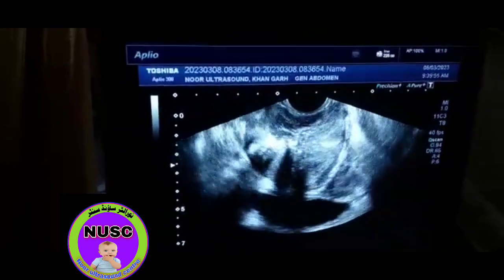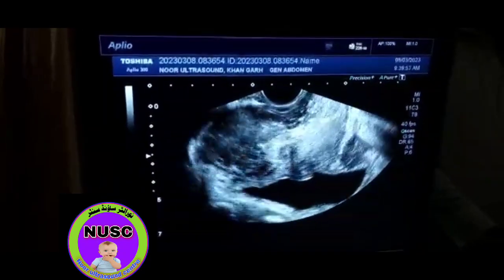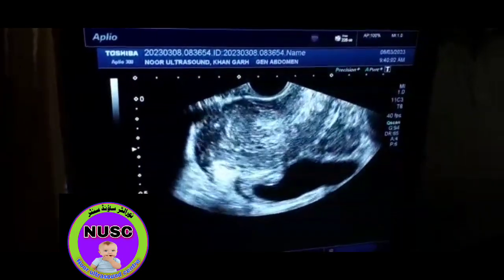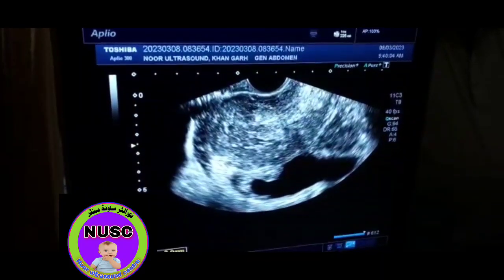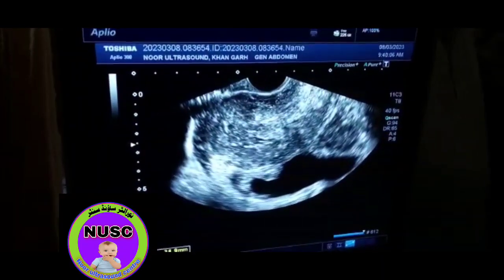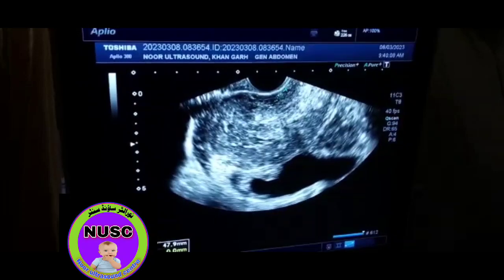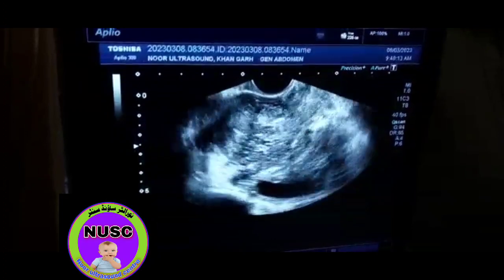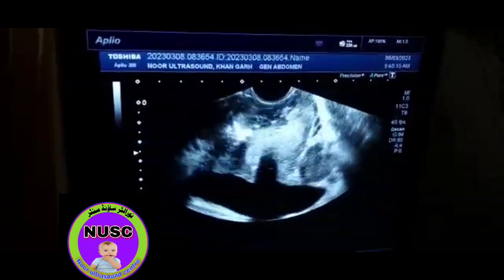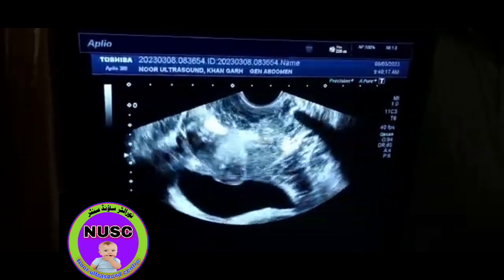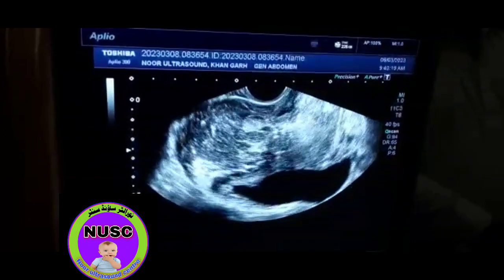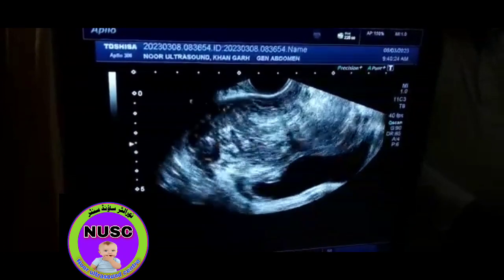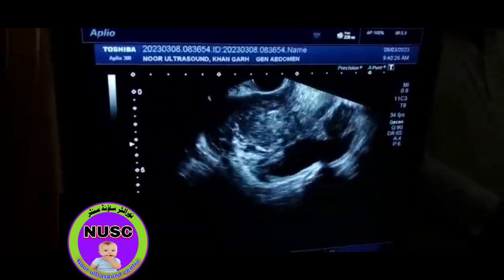This is the peripheral zone. You can see this is a mass about 5 by 5 centimeters, which is arising from the right lobe of the prostate. It is also involving the associated portion of the wall of the urinary bladder.